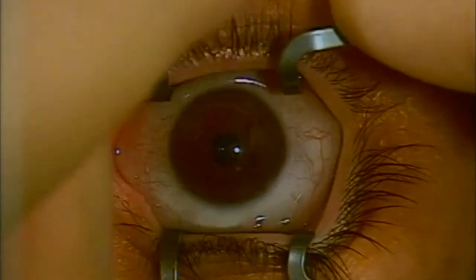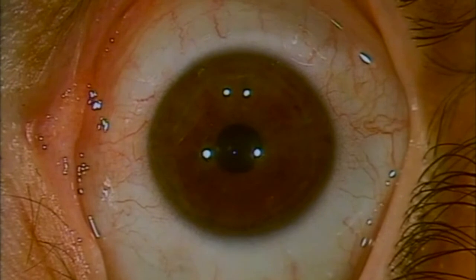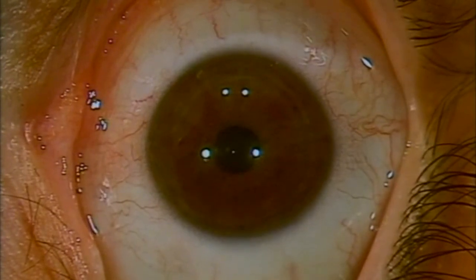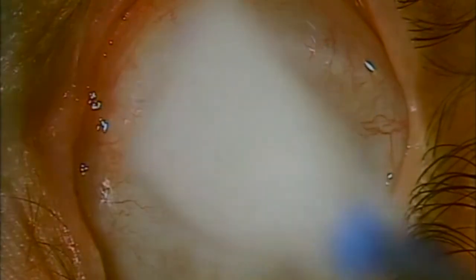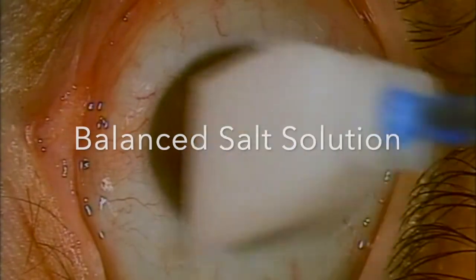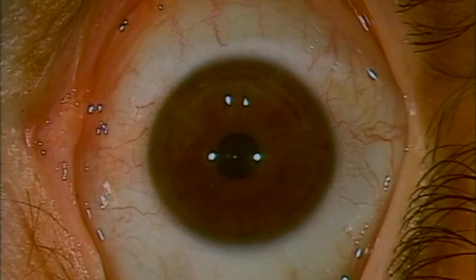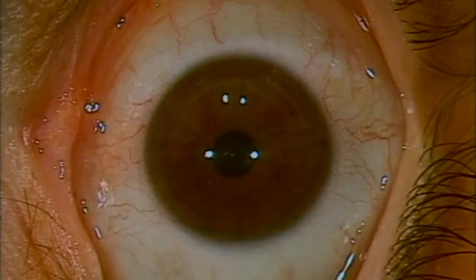So there it is — a few little tips on TransPRK that really revolve around keeping the patient relaxed during surgery and keeping the tear film uniform prior to ablation. If the tear film does start to break up after you've locked on the tracking, it's just a quick freshen up with a super wet sponge with your chosen liquid masking agent — I'm using BSS here. Wait 20 seconds for the tear film to be uniform and then apply the ablation.